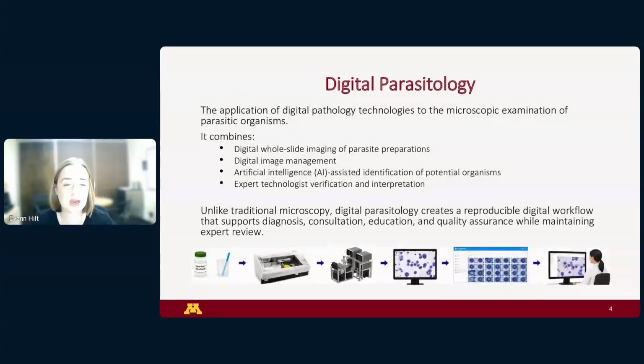But before I get into our actual experience, Jacob gave a really great overview of TechSite as a whole, but I just want to focus fully on digital parasitology. This is the application of using microscopic examination for parasitic organisms, and it combines whole slide imaging of our parasite preps, digital image management, AI-assisted identification for potential parasitic organisms, and then, of course, our technologists and experts actually verifying and interpreting what AI has potentially identified.